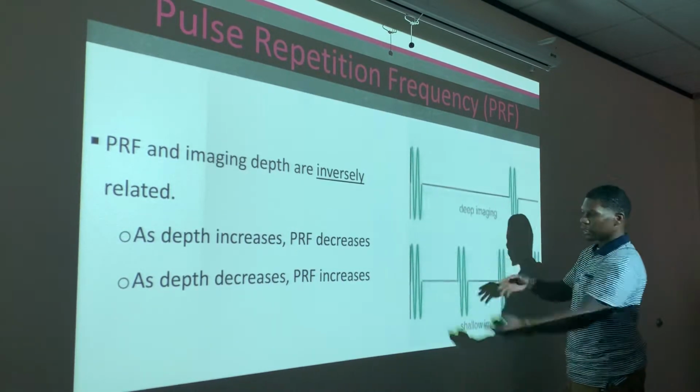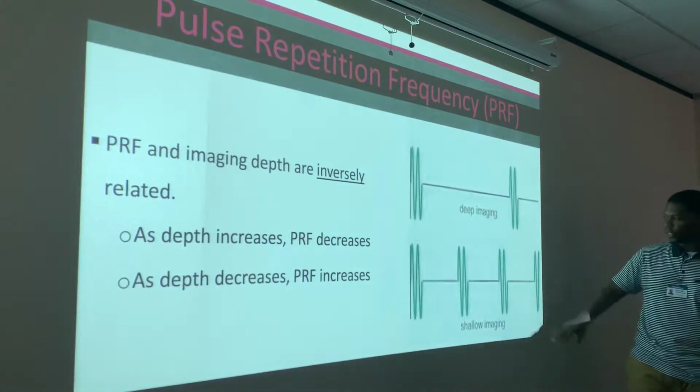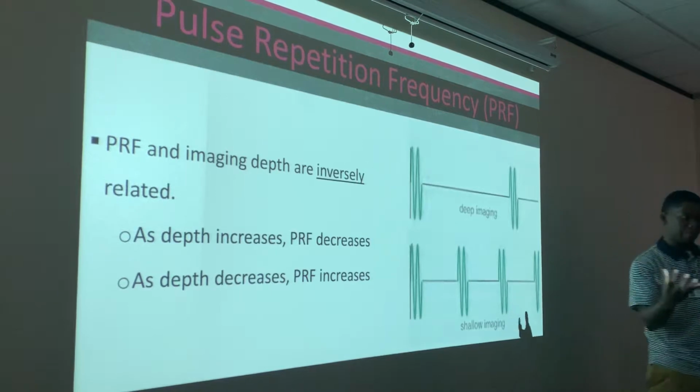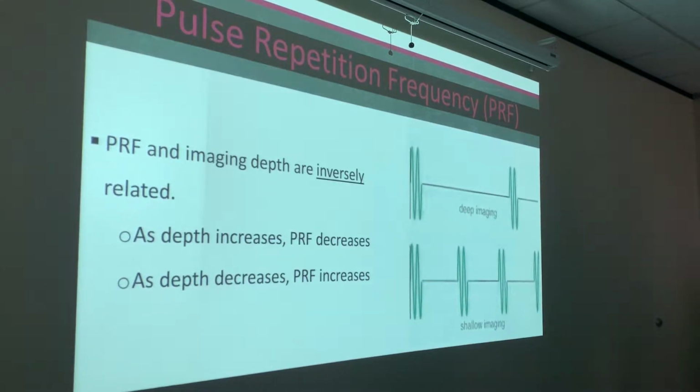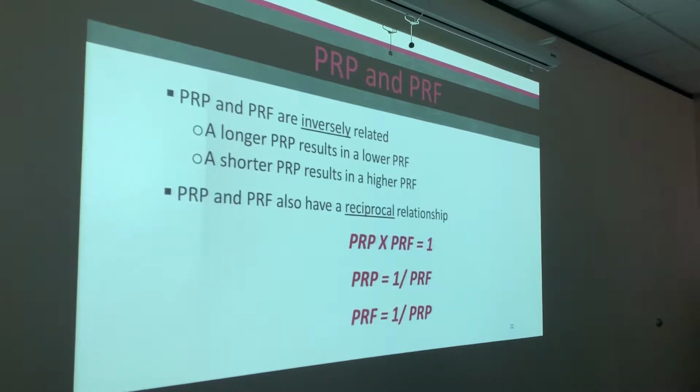From shallow, look at them. That's the only difference. All of my pulses look exactly the same. The only difference is the space in between the pulse, that time in between the pulse. That's all you're changing right there. Okay. All right, I already talked about this.